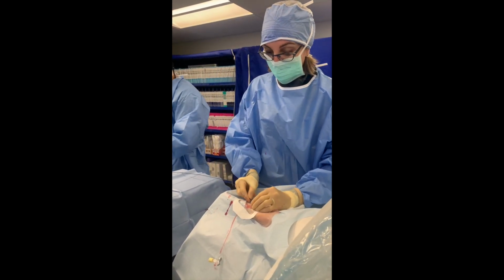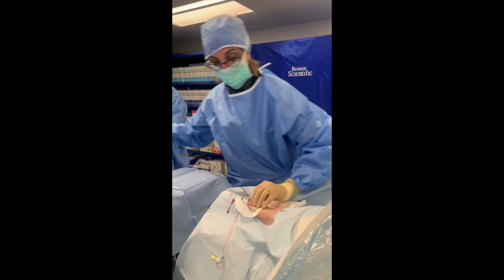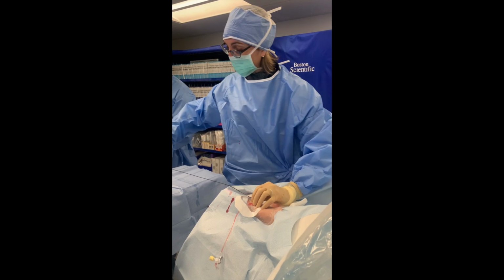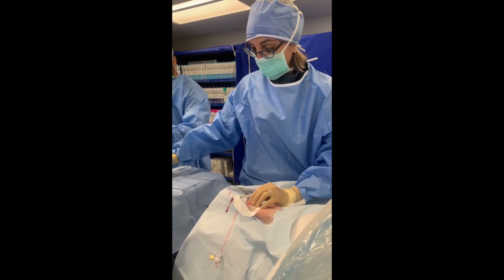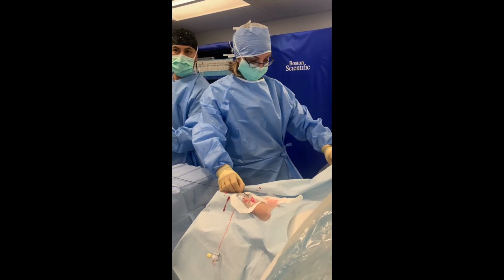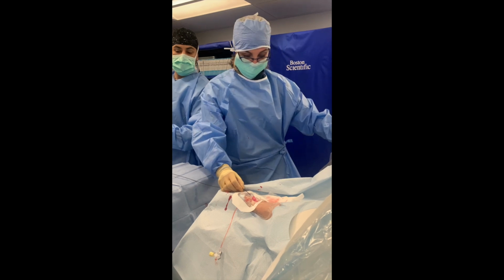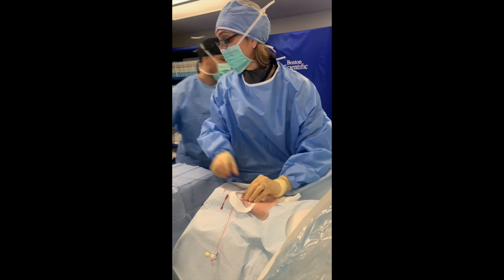Okay. So the other thing we do here is I have a warm saline bucket. This is Isaac's genius. I try to make things kind of warm and smooth as they go through this vessel to prevent spasm. So I make sure our glide is well hydrated and warm, because it just doesn't make any sense to put cold saline into an arm.